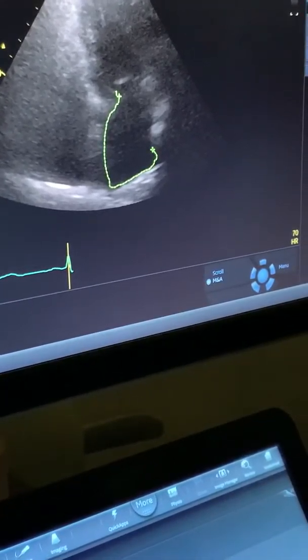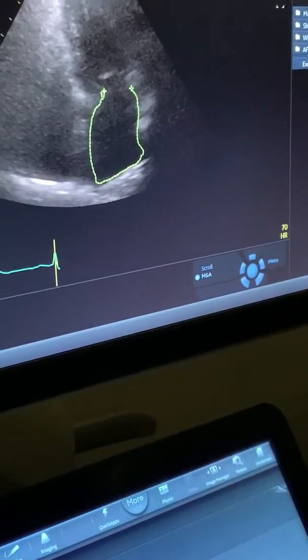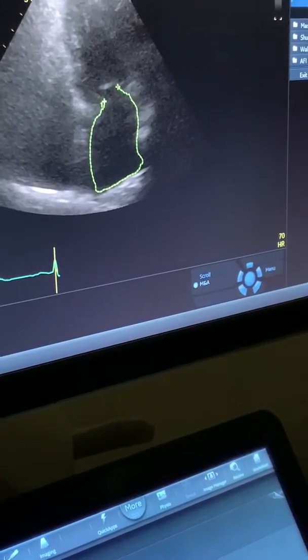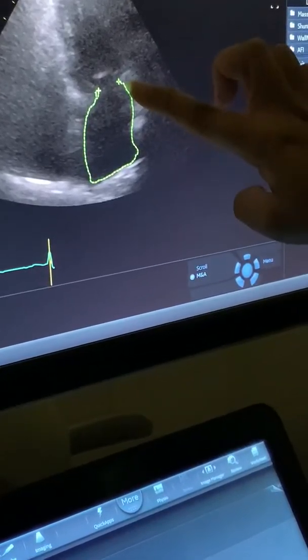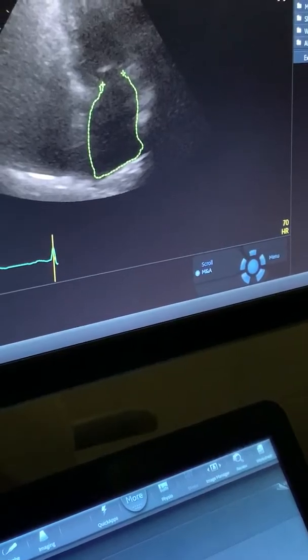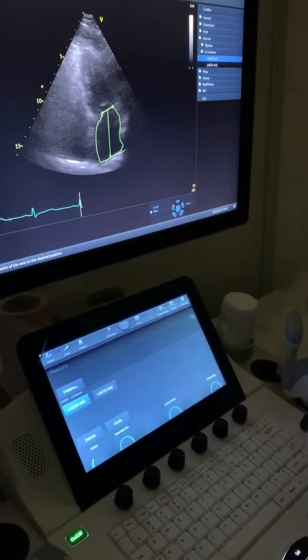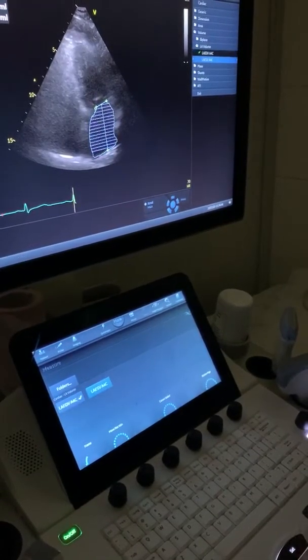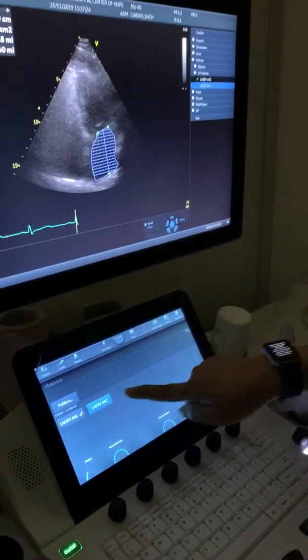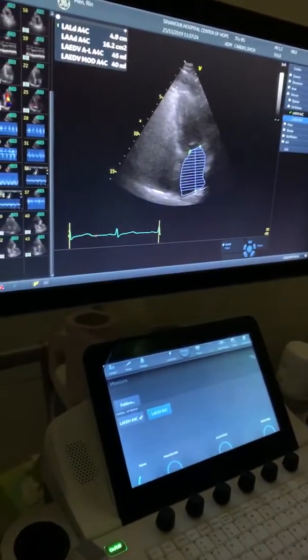Up. Okay, no, don't close it. Yeah, only on the edge. Okay, on the edge. From there you set. See, this one you have to put in the middle. Move the trackball. Yes, set. Okay, now your systole. But you have to move now frame by frame. Move your trackball.